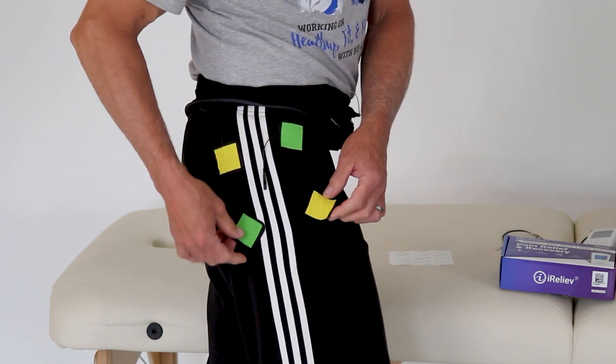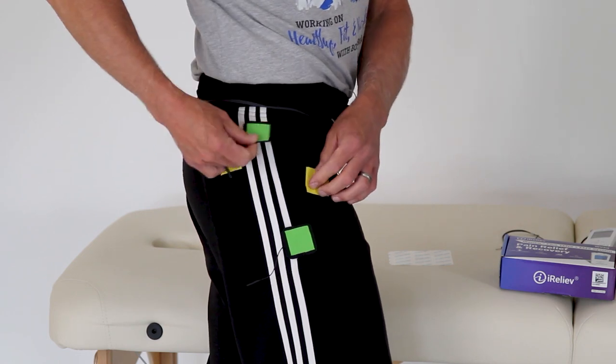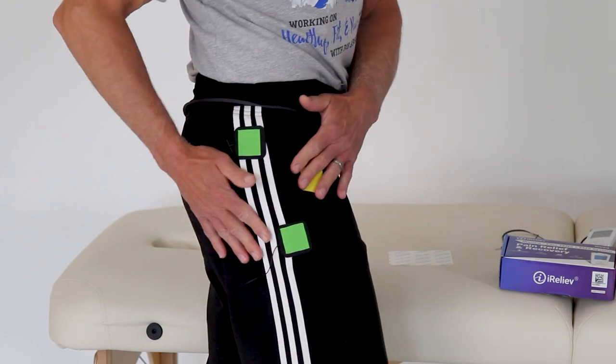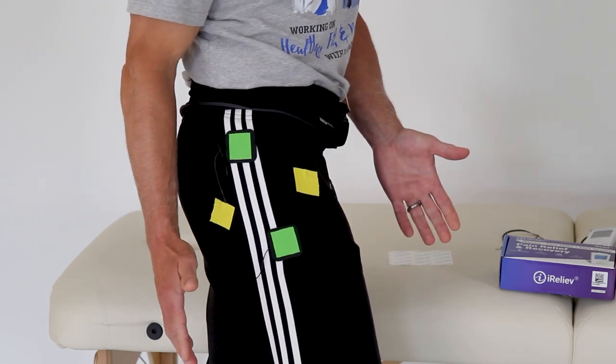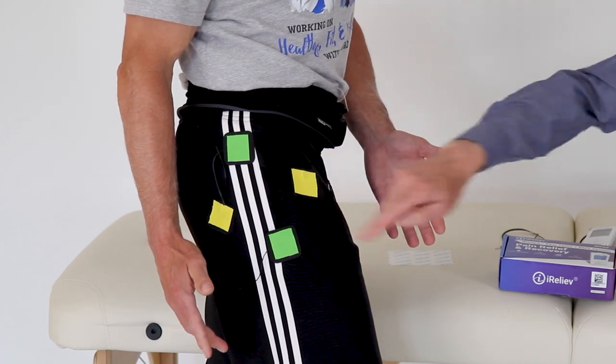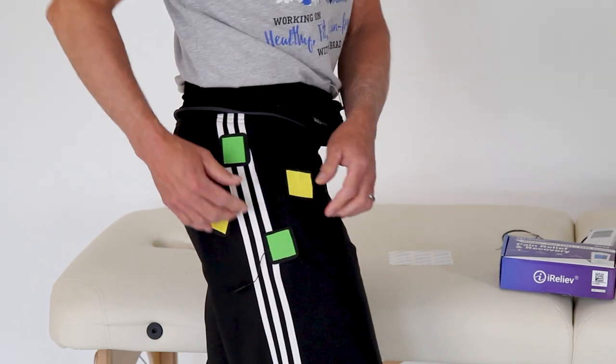If that is not comfortable, it's not working real well, you can just rotate 90 degrees. There we go. Sometimes little subtle differences like this can be very, very helpful. So again, you've got current running this way and this way. Now you've formed a cross. The cross and the X.